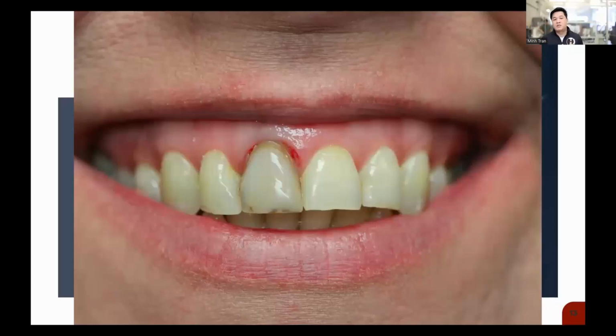As for my personal experience with smile design, back in the day, and kind of how I started, I just grab a picture from the doctor, throw it into Photoshop, and you just cut out the tooth, mirror it, and I think you can really appreciate even just seeing this. This is just a quick grab, highlight, select, copy, mirror, and you're able to see immediately what kind of results you're able to get.